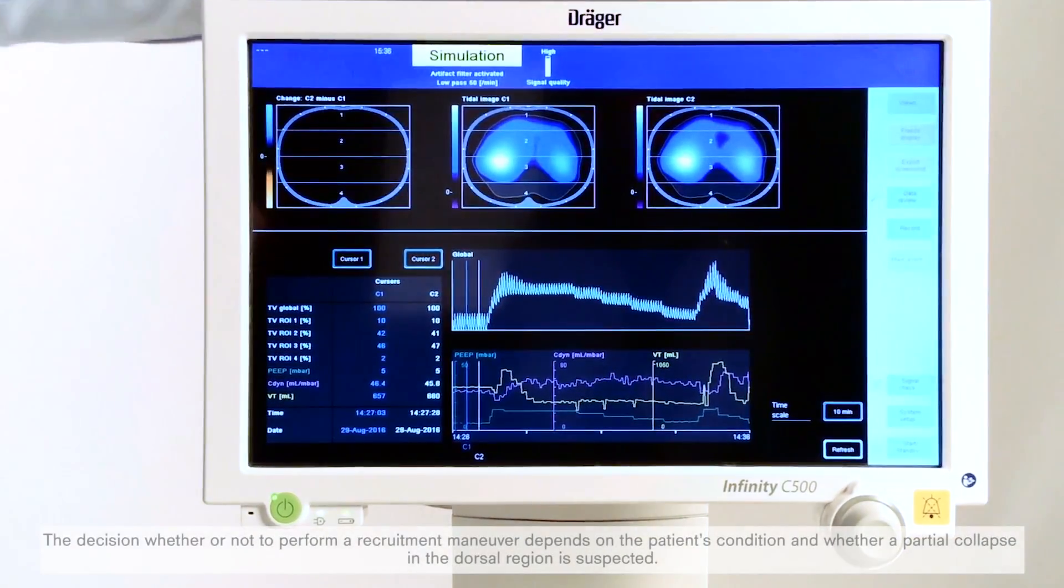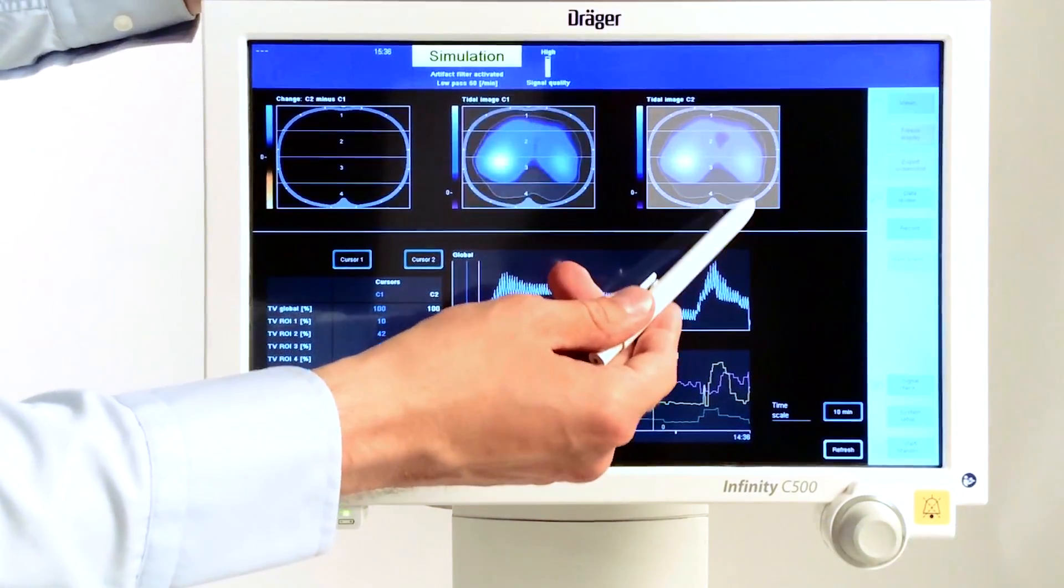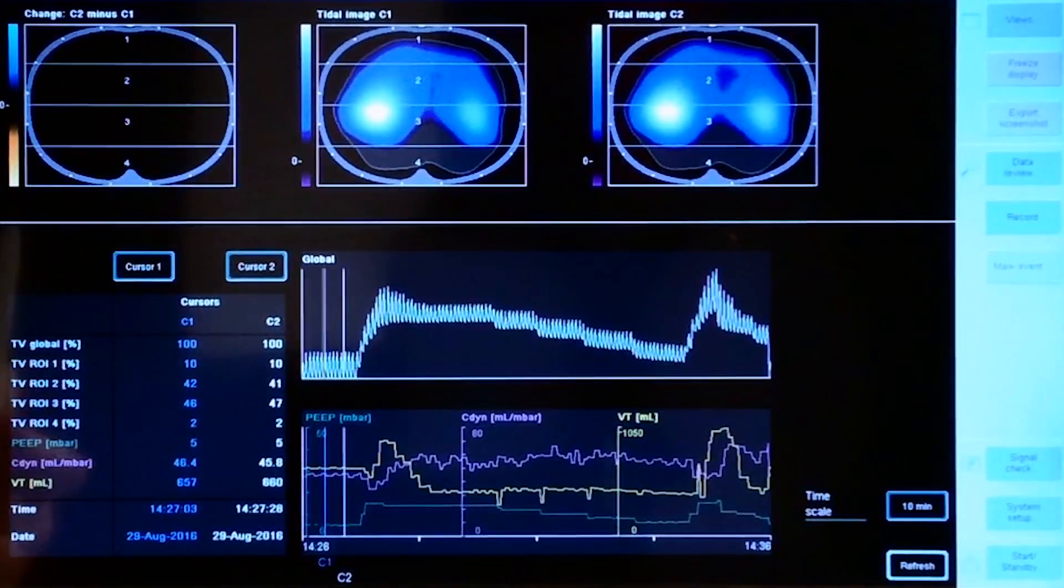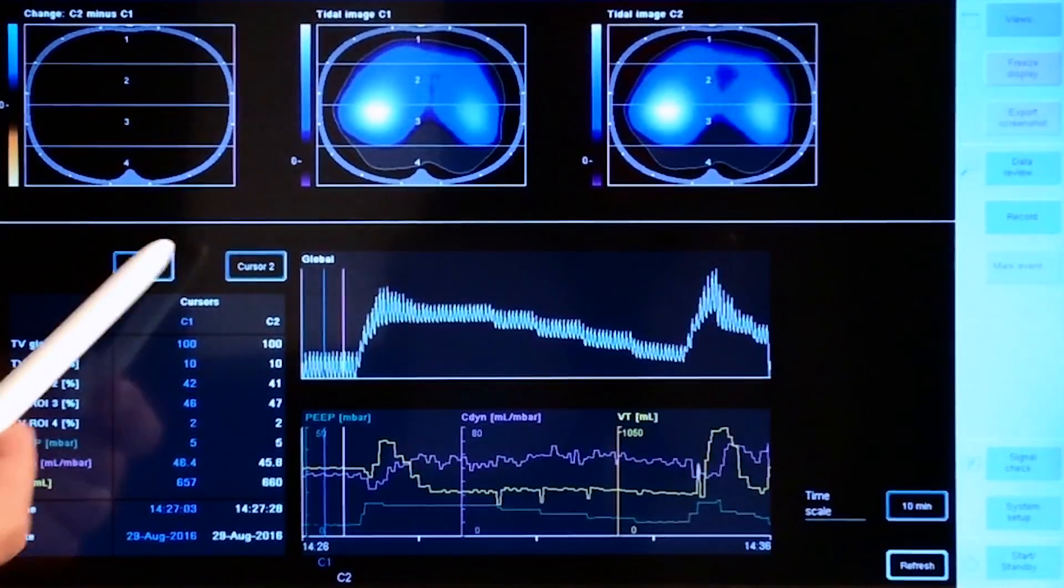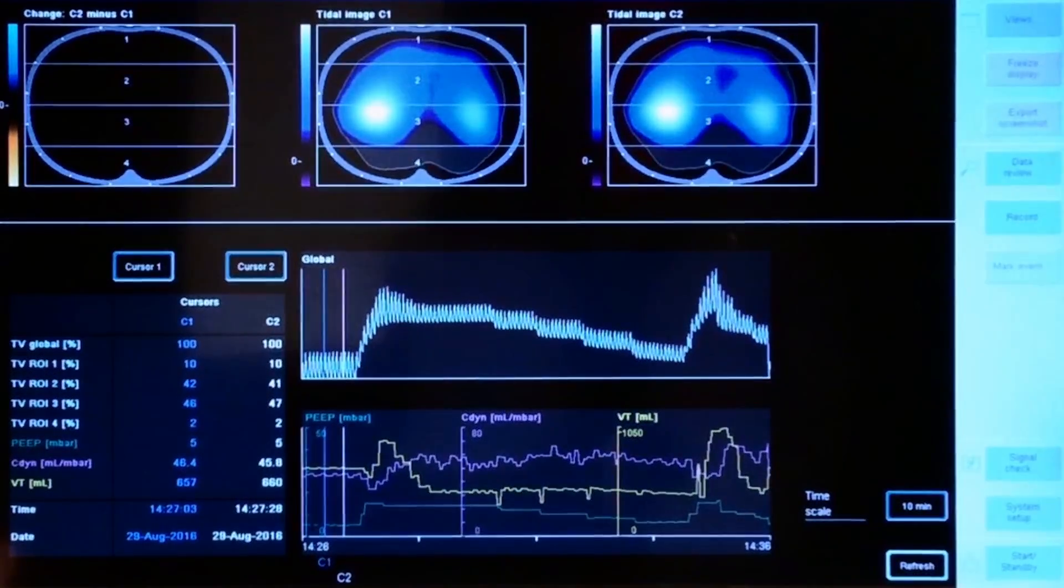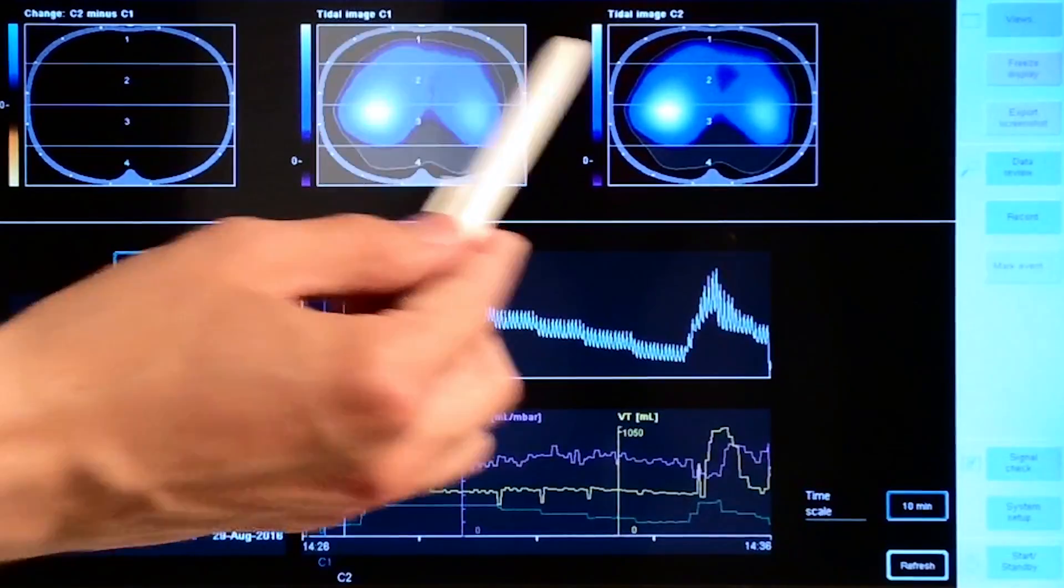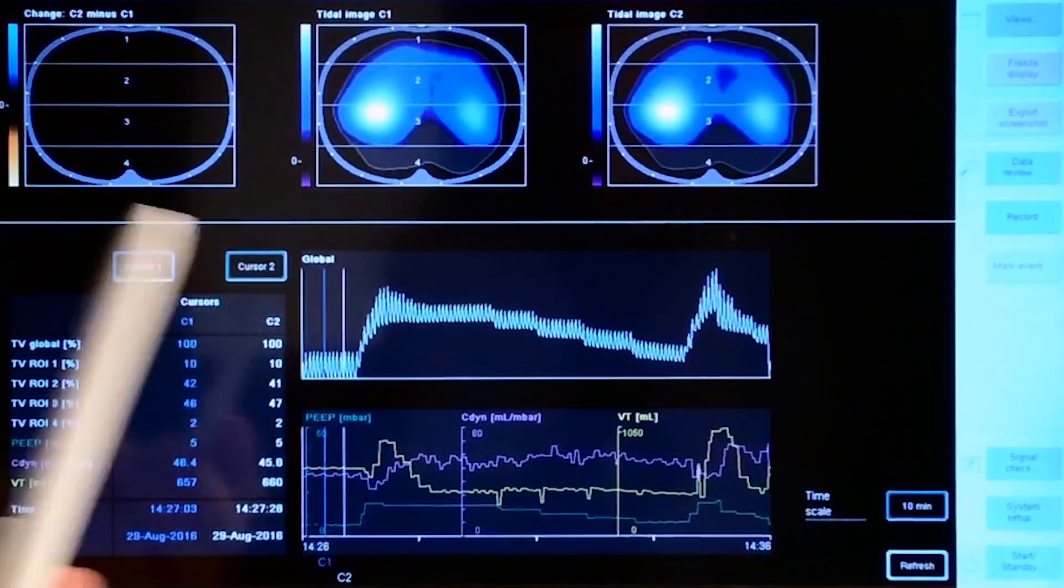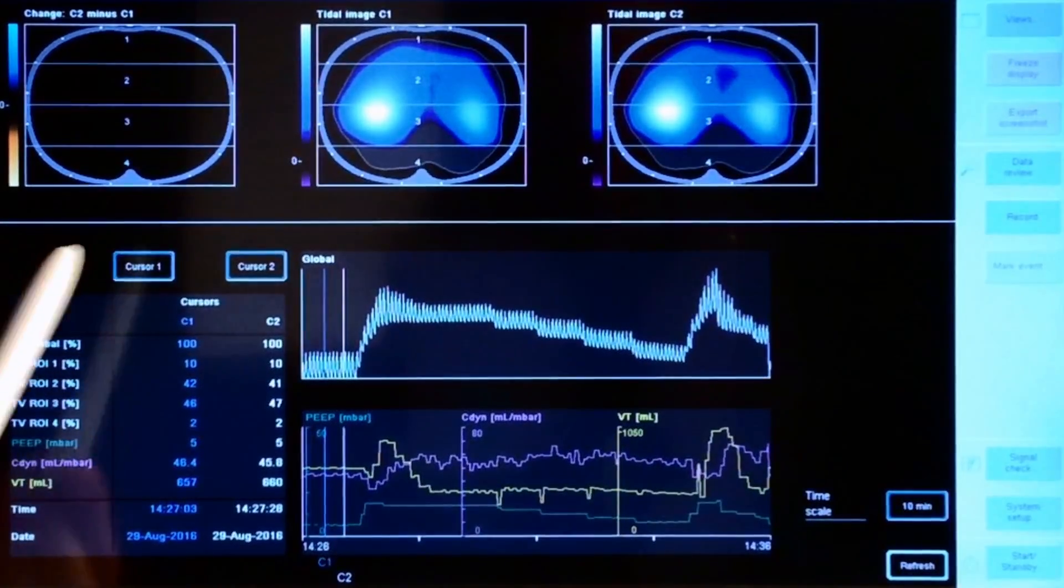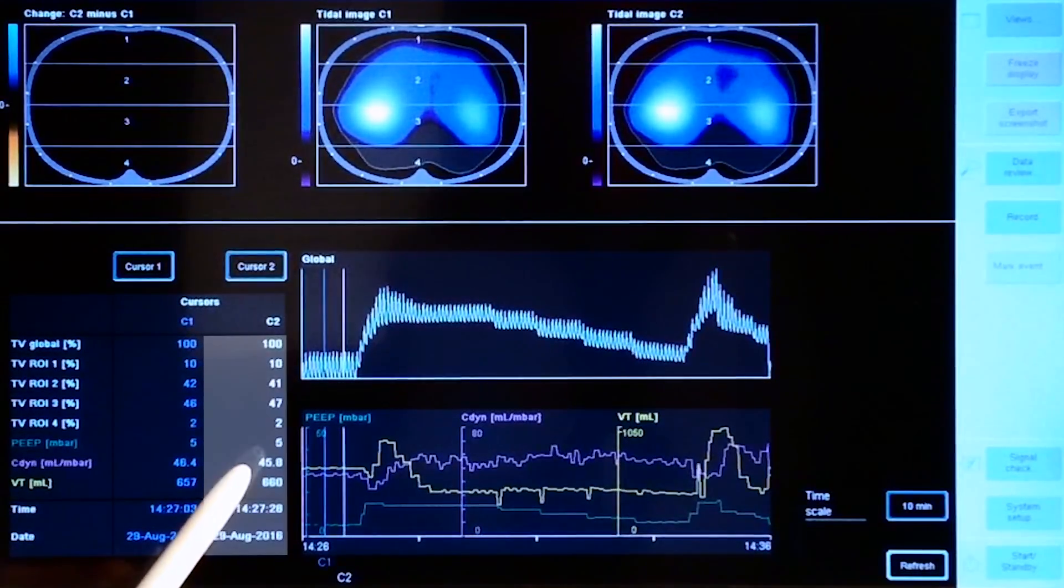The basic principle of this trend view is to compare two different time points. Cursor number one is used as a reference and cursor number two as a comparison point. Each cursor is represented by its own tidal image and corresponding trend table values.